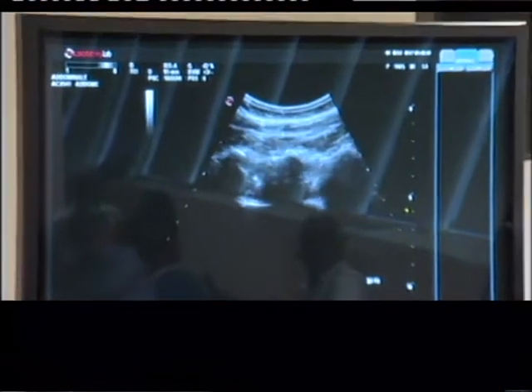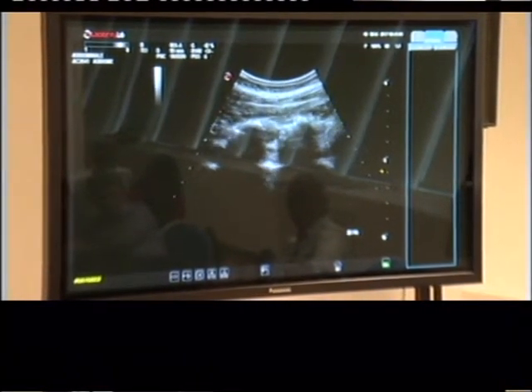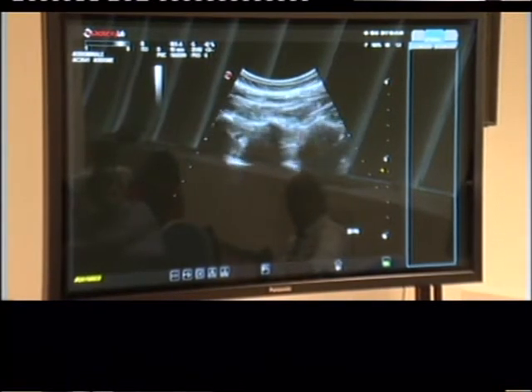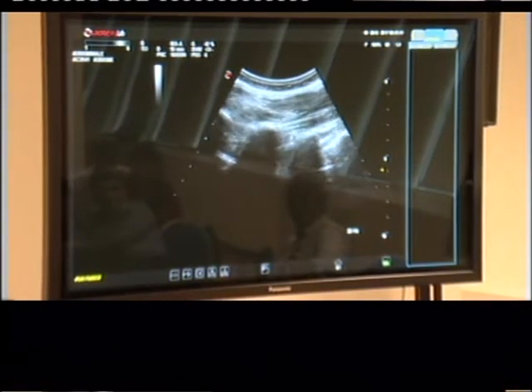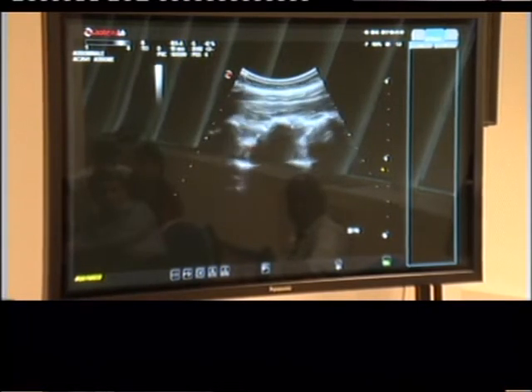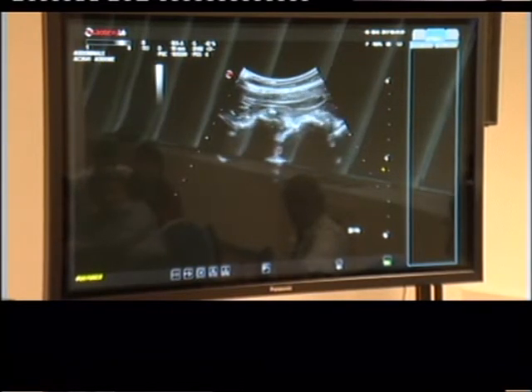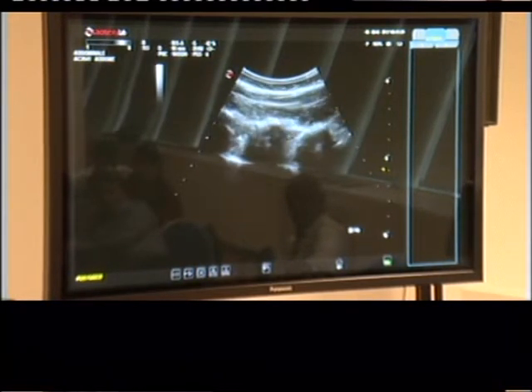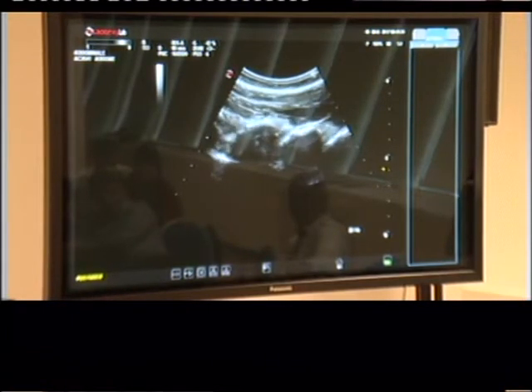So here you can see there's the cauda equina, and this is your lamina, and then you can keep going down. So this is 5, 4, 3, 2, 1, and T12. And that's the conus. So this is the start of the cauda equina. So this is the epidural space. There. All right. Everybody's got it?